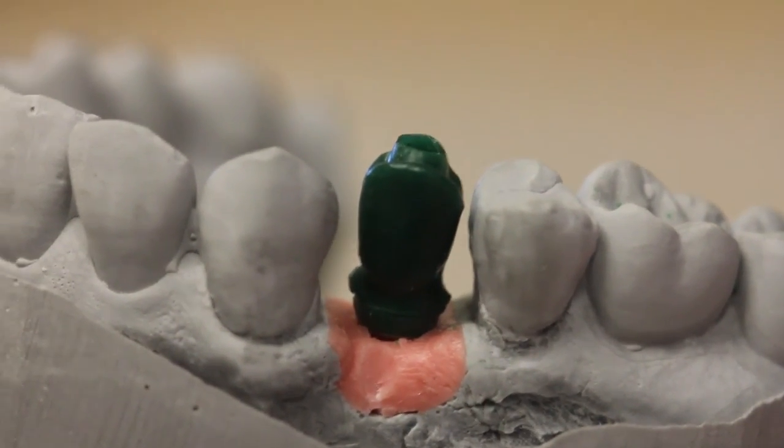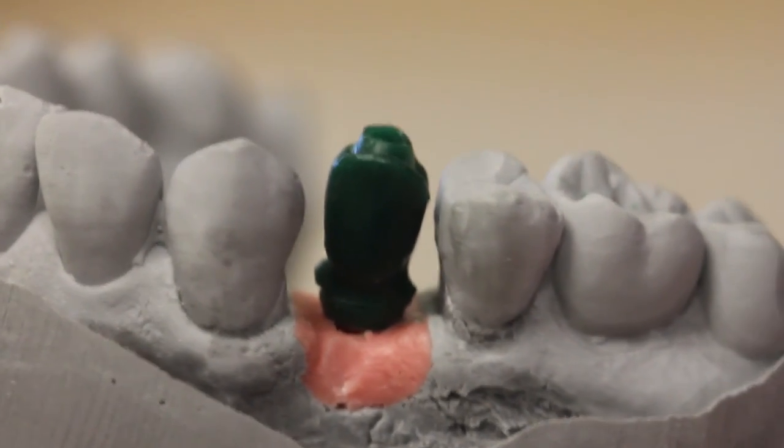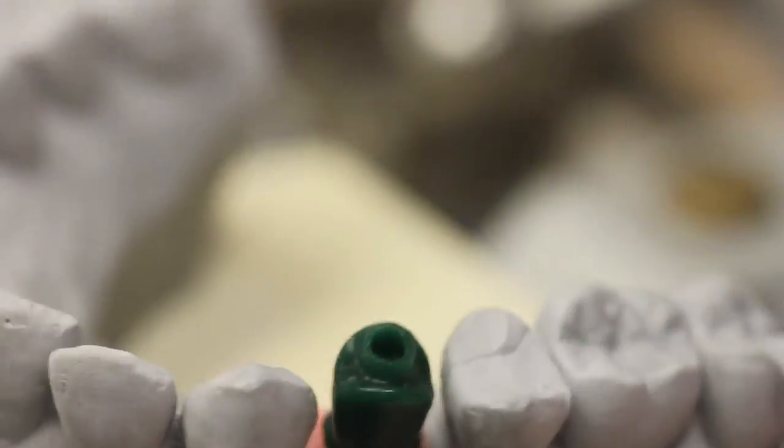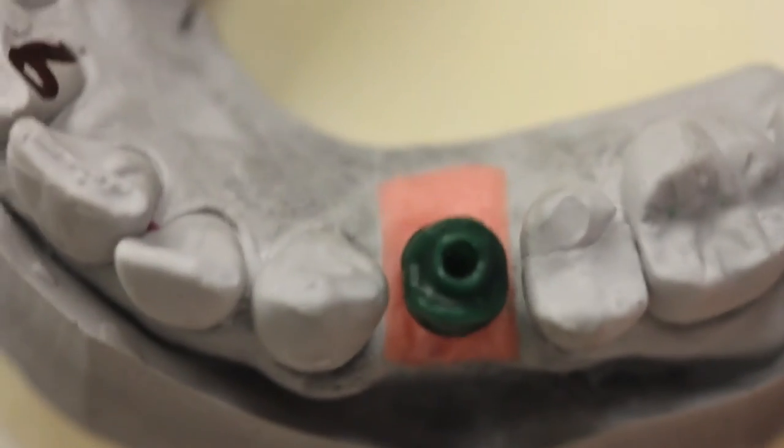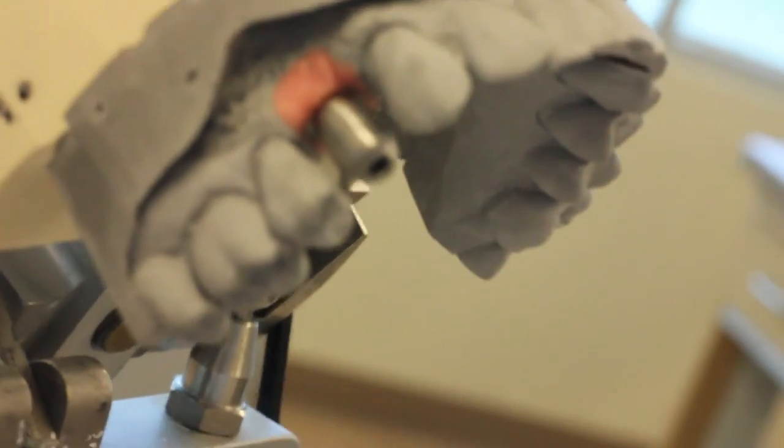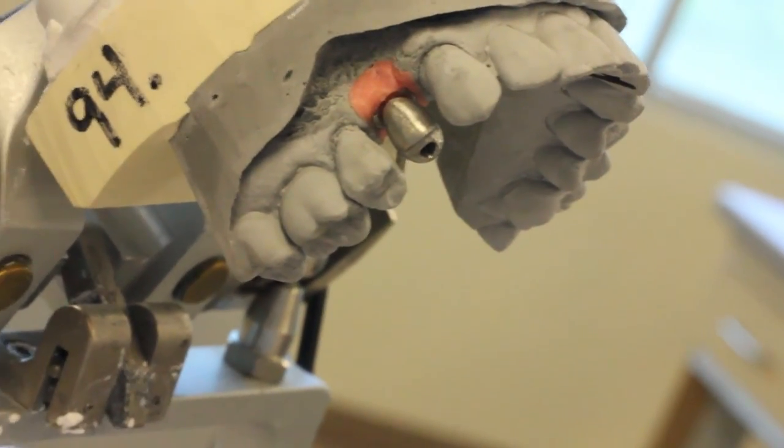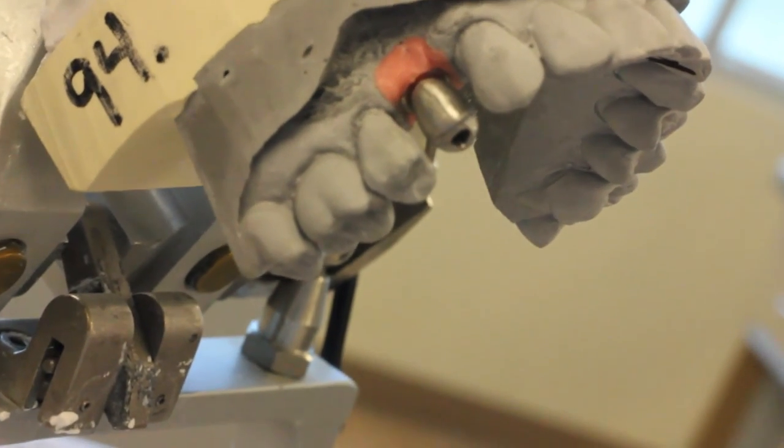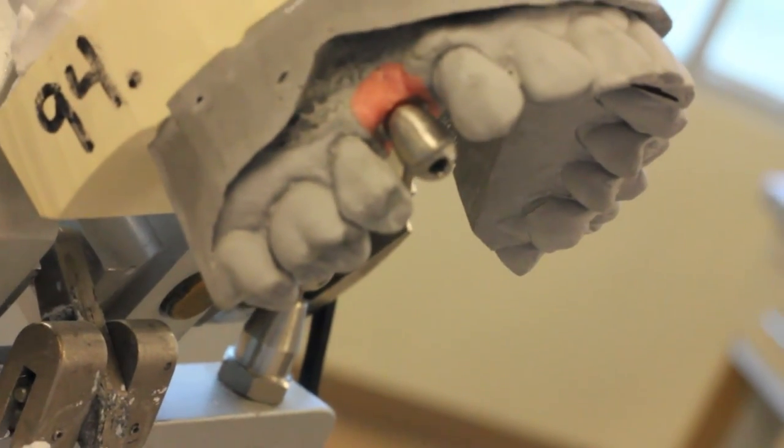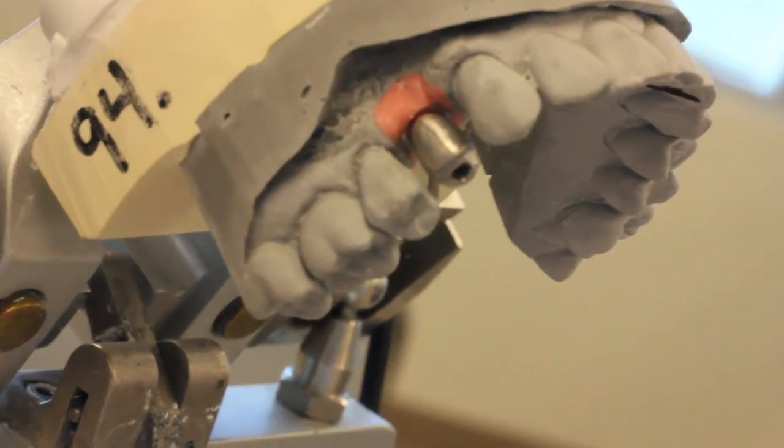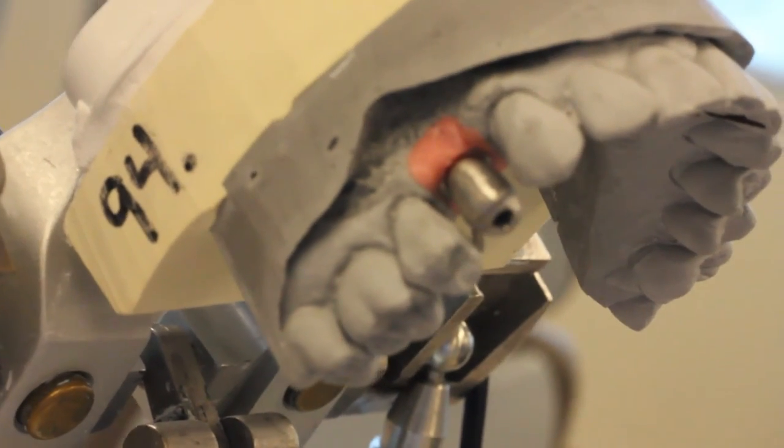They'll be able to wax up to the shape of the crown with a cutback. Then this wax pattern gets casted into metal. Once it's casted into metal, porcelain will be stacked onto it to get us a PFM. In this case, it's a screw-retained porcelain-fused metal crown.